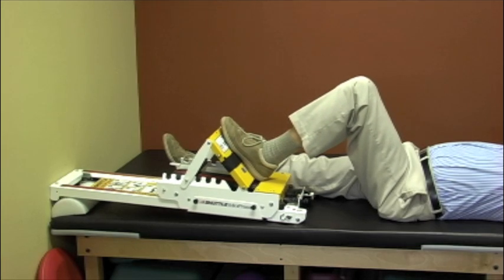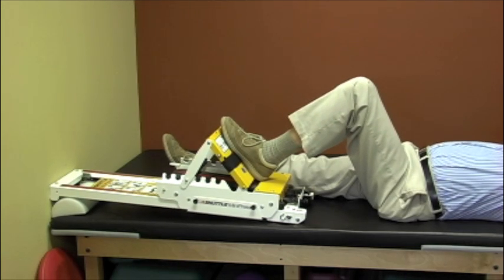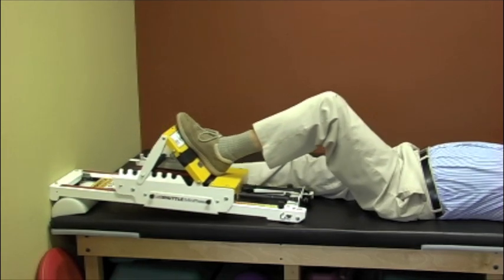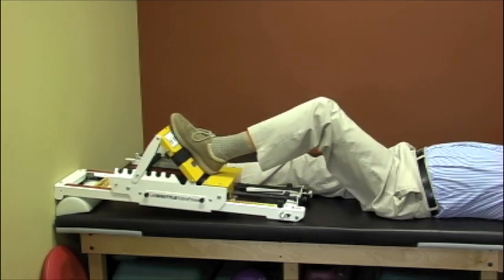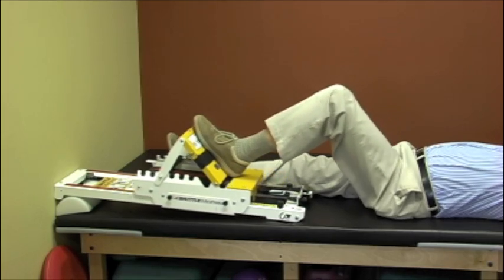Just take that situation as it comes. From this position we're working closed kinetic chain on the left lower extremity, and functionally I would be working on leg strength and even his ability to go from sit to stand while he's lying down.